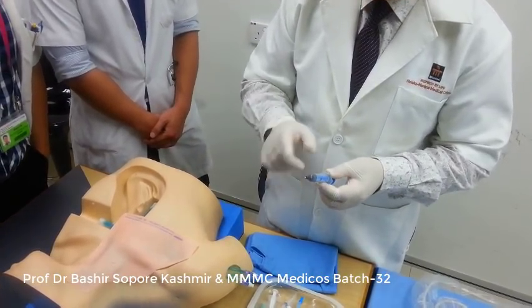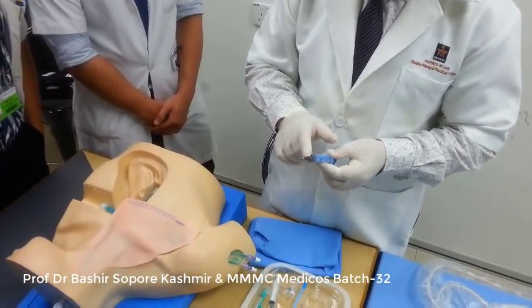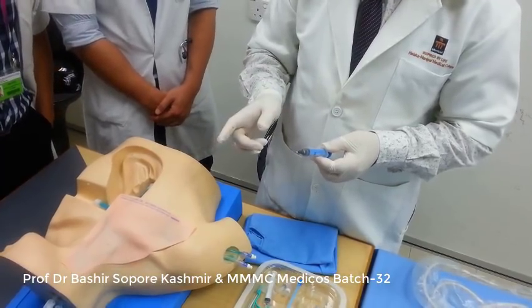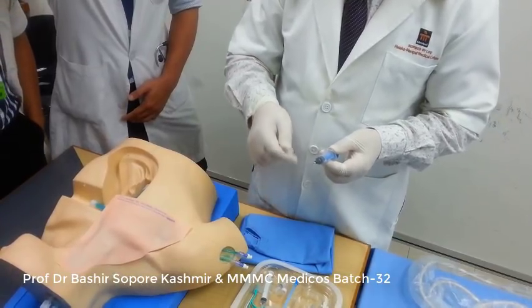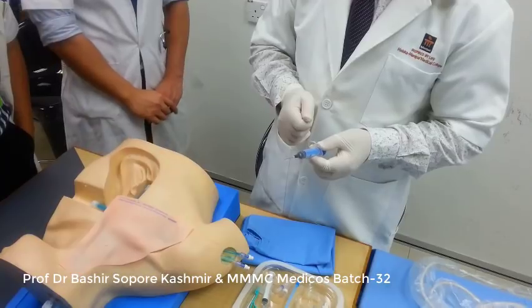Most books and most videos do not talk about this. I am laying stress on this step because it is a very important step, that after the local anesthesia you find the internal jugular vein with the needle finder. Why?